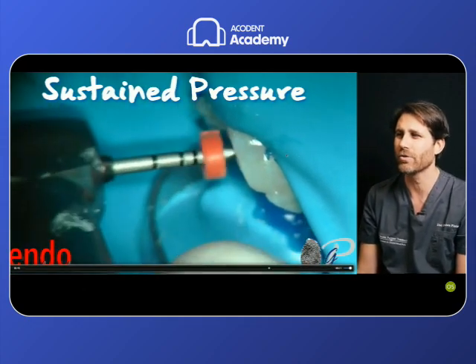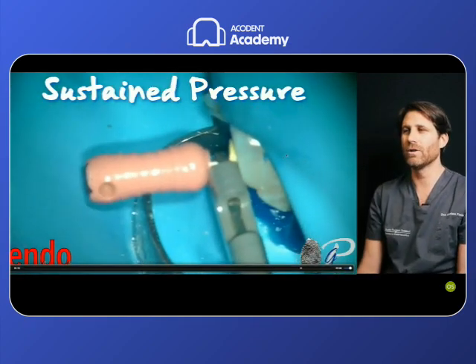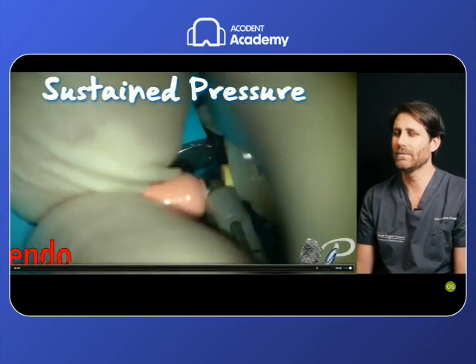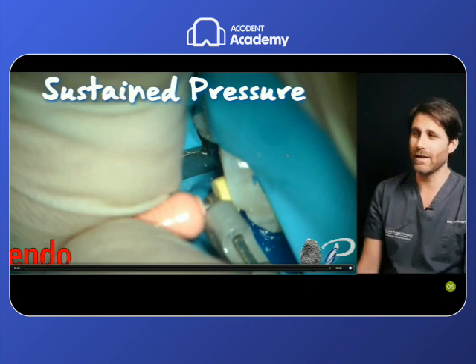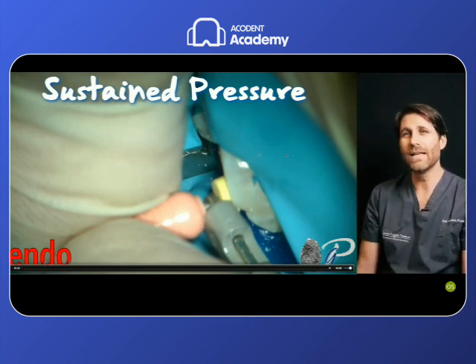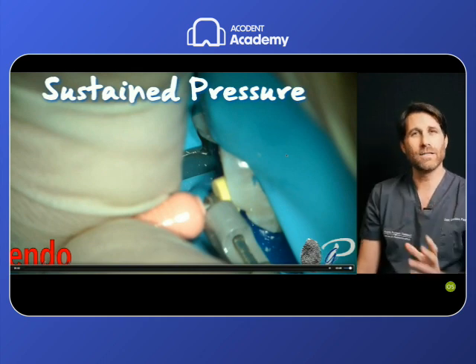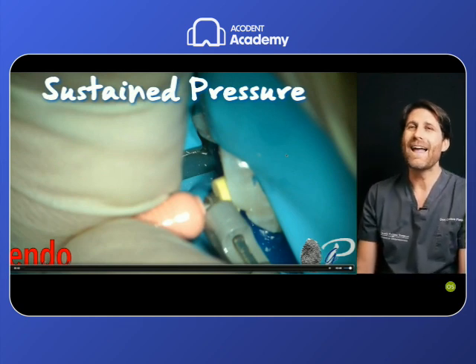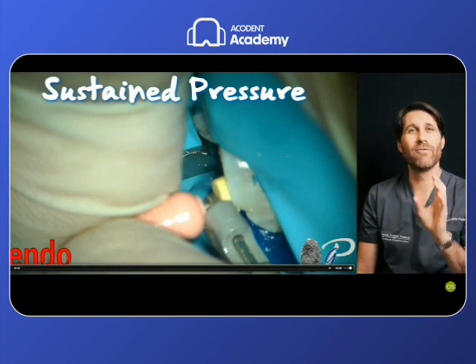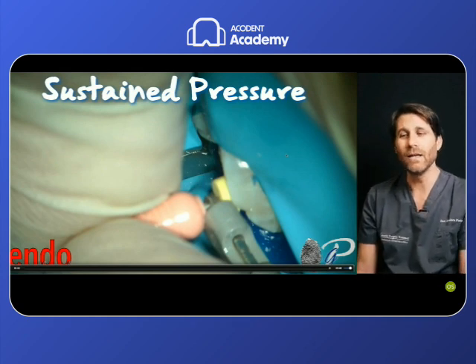The sustained pressure: go there, activate, push 1 second and go away to obtain the patency of this root canal, then confirmed with the size 6, size 8, size 10 stainless steel file. So the sustained pressure is a technique that goes beyond the indication by the manufacturer, started with the Reciproc 25 mm M-Wire and can also be performed with the Reciproc Blue, and honestly can be performed only with this file because this is the only file that has the characteristics to perform this technique to scout the unscoutable root canals in the apical third.